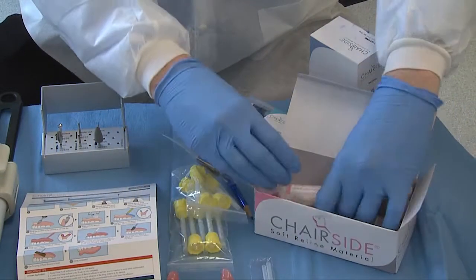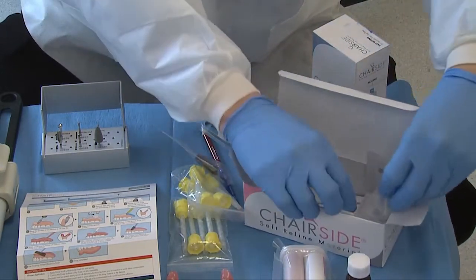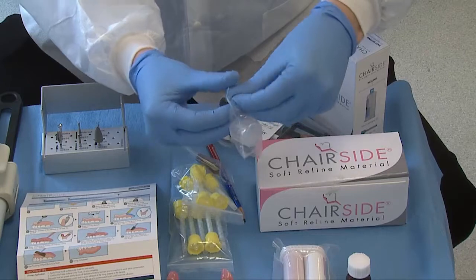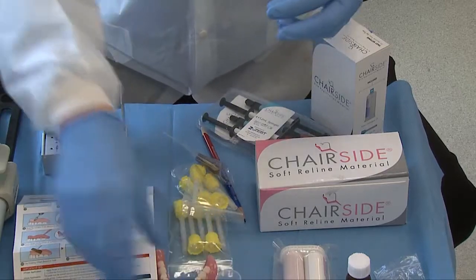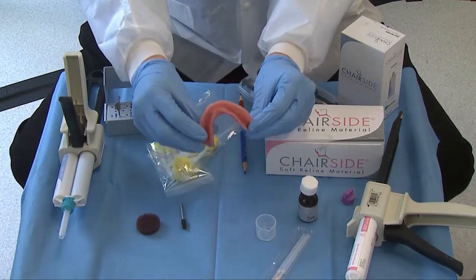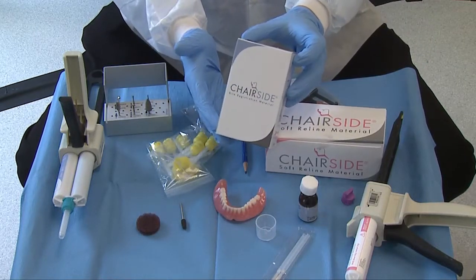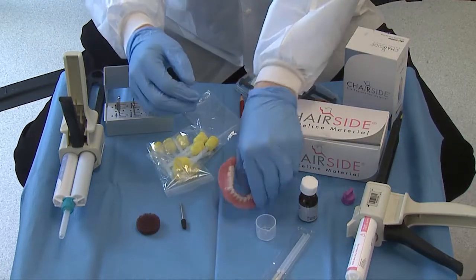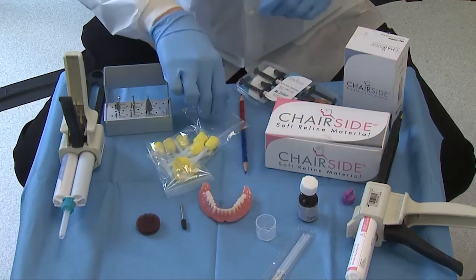Inside the box, we have a brush and our chair side soft reline material, including an adhesive. The chair side soft reline material does require an adhesive before it goes into place. First, what we need to do is mark on the inside part of the denture where the locator abutments are. I'm going to use my chair side bite registration material — a fast-acting bite registration — and inject it into the intaglio surface of the complete denture corresponding to my implant positions.